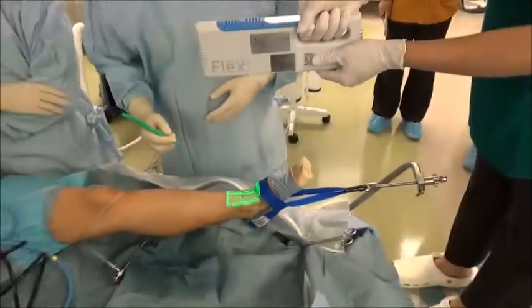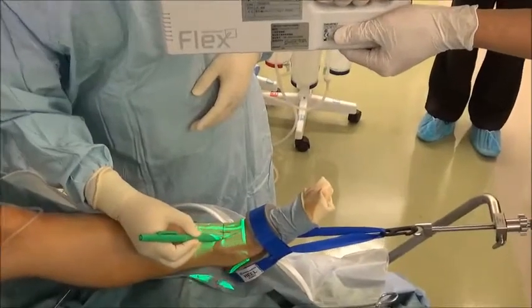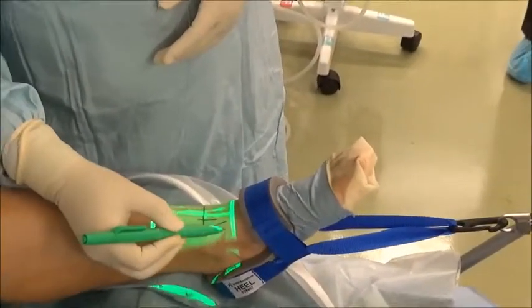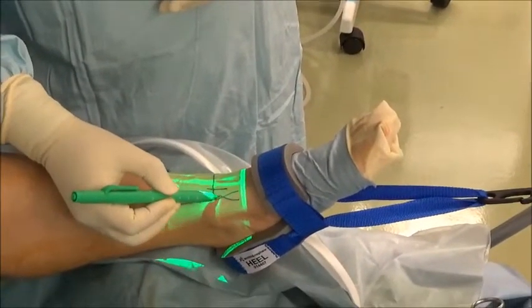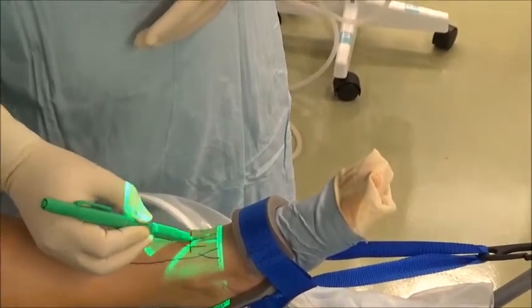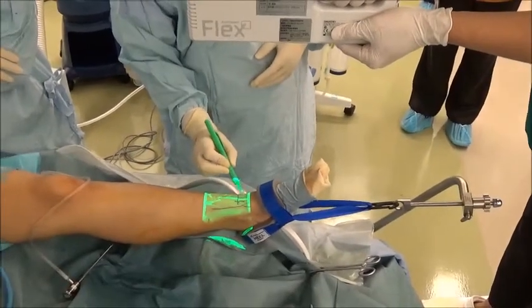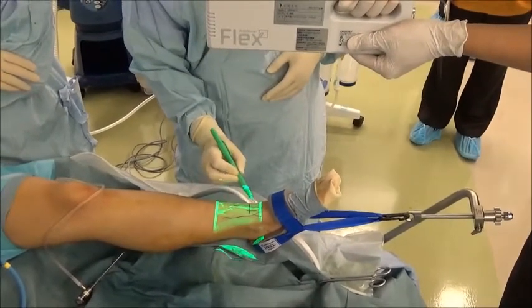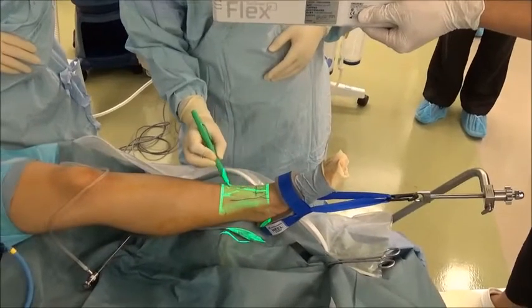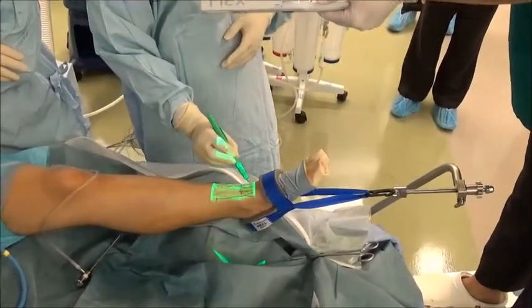Then we check the course of the vein around the portal site using the VeinView Flex. The imaging focus distance of the VeinView Flex is 30 cm, so the VeinView Flex is positioned a safe distance from the sterile surgical field. The anterior aspect of the ankle joint is illuminated with the VeinView Flex.